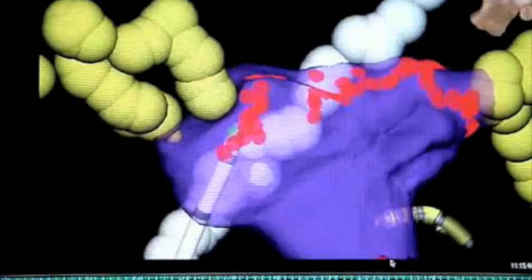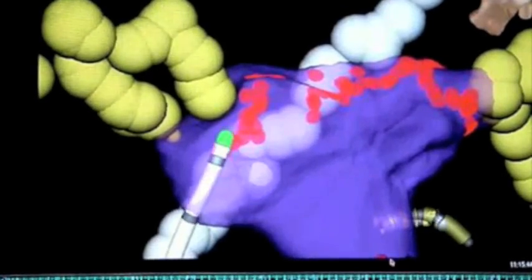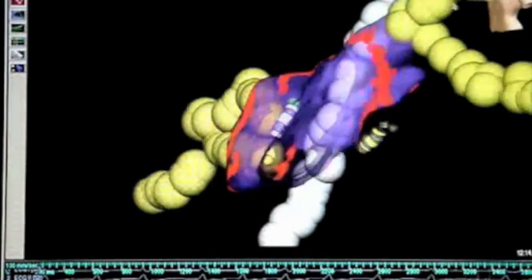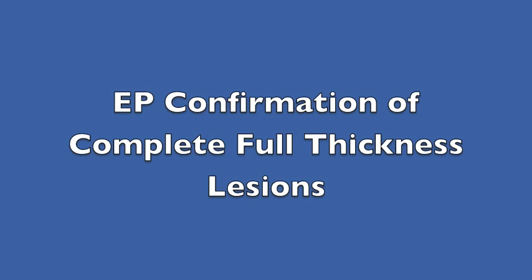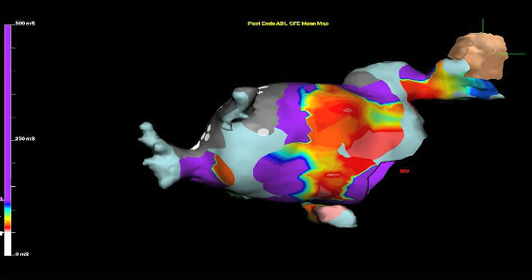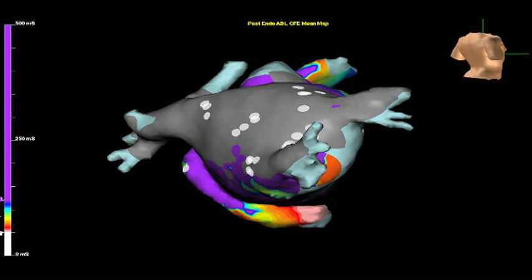Initially, the epicardial burns attack the outside of the heart, and the endocardial burns attack the inside of the heart. Following a complete isolation, we are able to confirm the completeness of full-thickness lesions. Following this, we are left with a heart in which the pulmonary veins are isolated and sinus rhythm is restored.